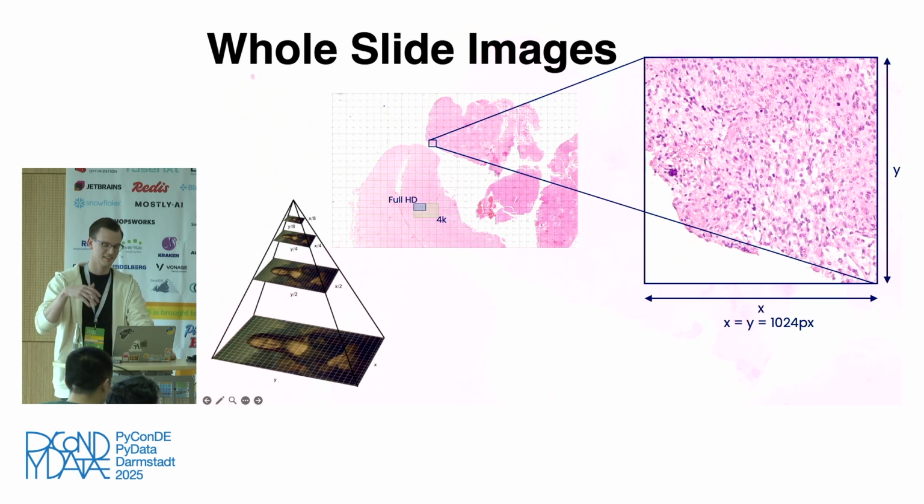So there is basically not one version of this image, but multiple versions at different resolutions. They are also tiled into different tiles, and you only get the tiles at the closest resolution you really require. So it's extremely performant to work with these images as soon as you realize they are whole slide images and you can work with them.